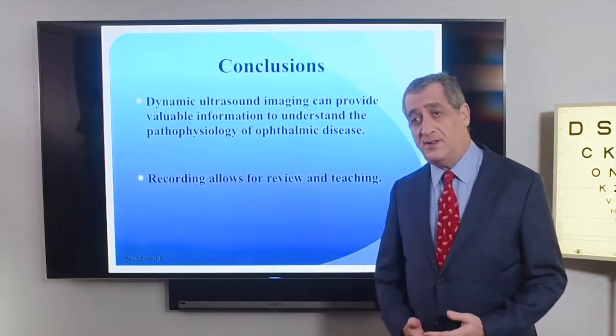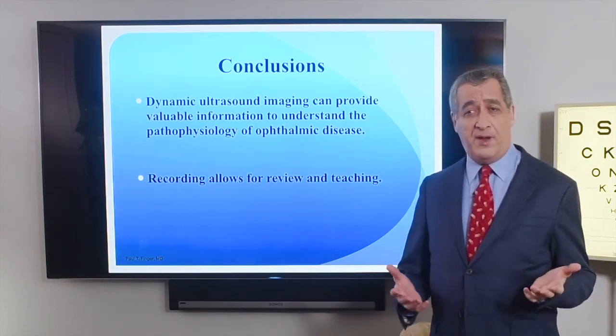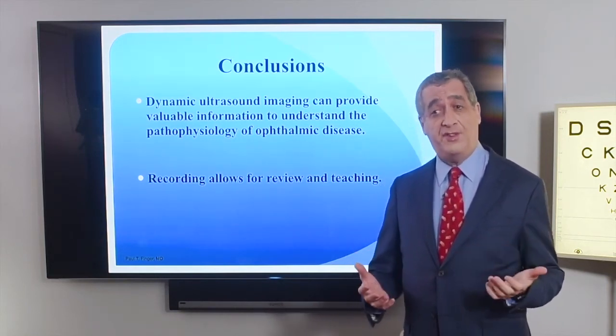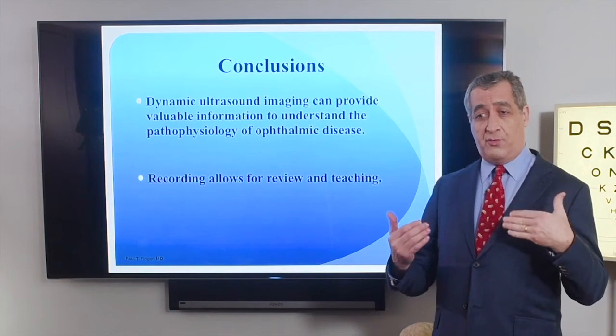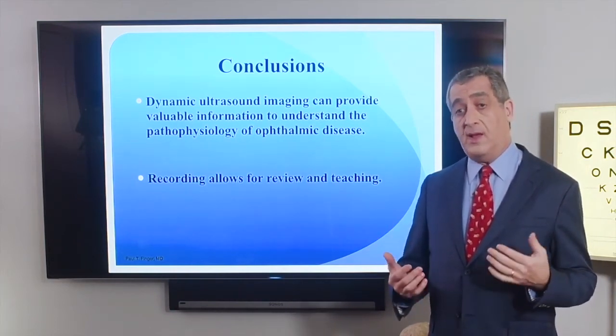So in conclusion, dynamic ultrasound imaging allows us new views and better ways to understand the pathophysiology of the tumors that we see. On occasion, it helps us differentiate benign from malignant tumors, vascular from low-flow tumors. It also allows us to record the entire exam and review it in the future and use it for teaching.